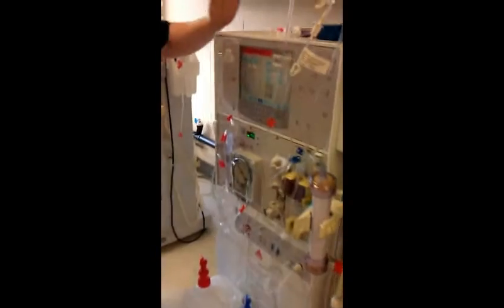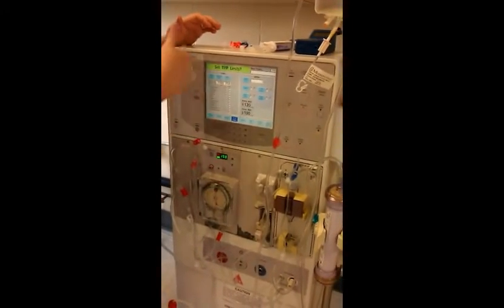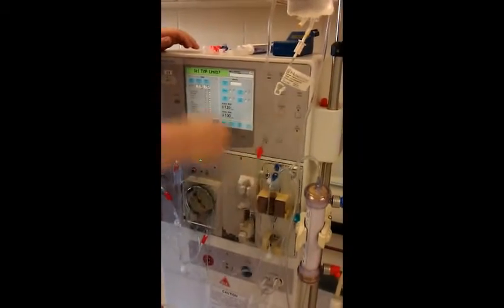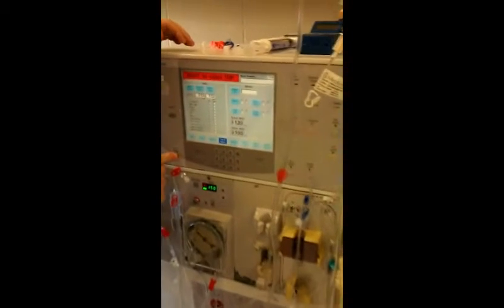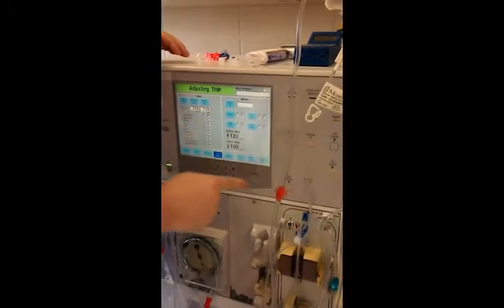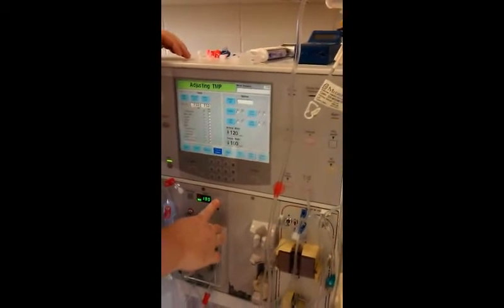The machine is alarming, so I need to reset my machine. I held the reset button so it cleared out the alarms. Now I'm going to prime — or recirculate this machine. Over here on the touch screen, I'll press the prime recirculate button and press confirm. My pump is running; I'm going to turn it up to 250.